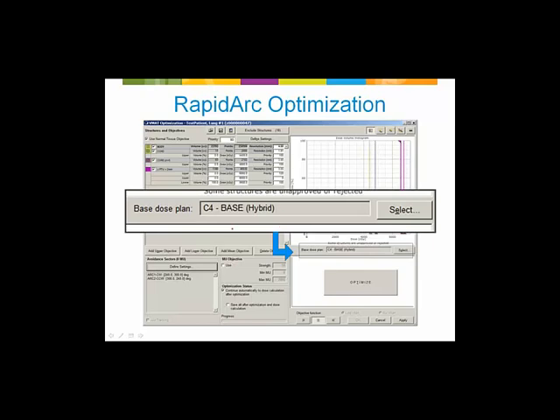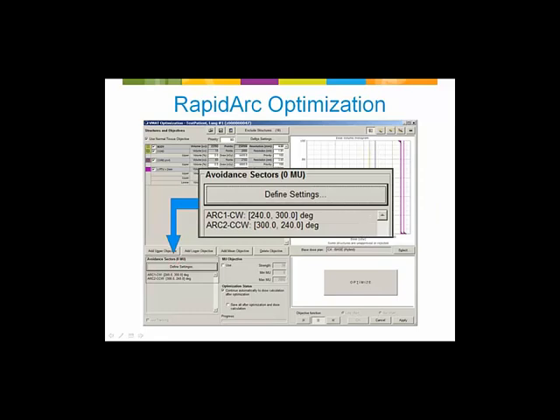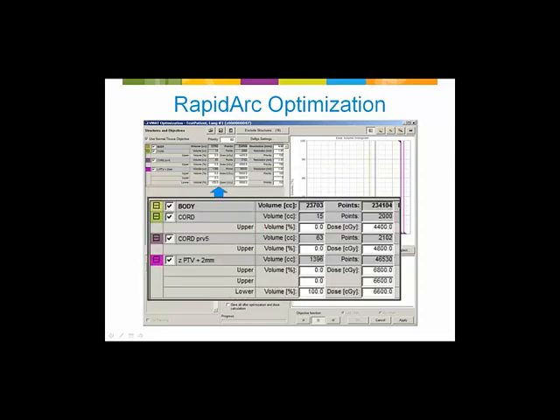Here we have a patient with a fairly large right-sided tumor. If I was to do this 3D conformal, it would be a very classic style of beam arrangement, an ant and a post oblique to get off cord, right? It's right out of the textbook. You get a nice, well, reasonably conformal distribution and good sparing of the contralateral lung.